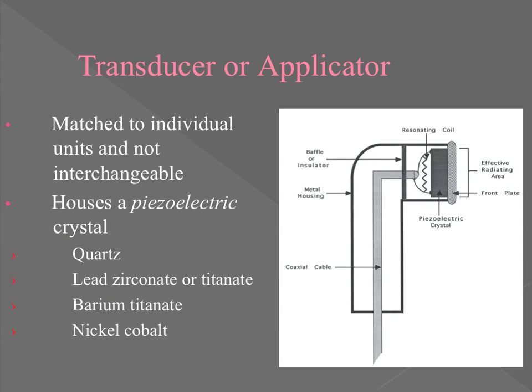So as we look at the actual transducer itself, because the transducer is just as important as the output box that it lives in, you can purchase multiple types of transducer heads. Normally, I wouldn't cover this in this lecture, but why not? Usually you'll get it in the lab, and I'm going to assume you're going to get it there, but I will cover it here too. So if you want to skip through this part, go for it. But I can tell you that this is an important aspect to therapeutic ultrasound application.